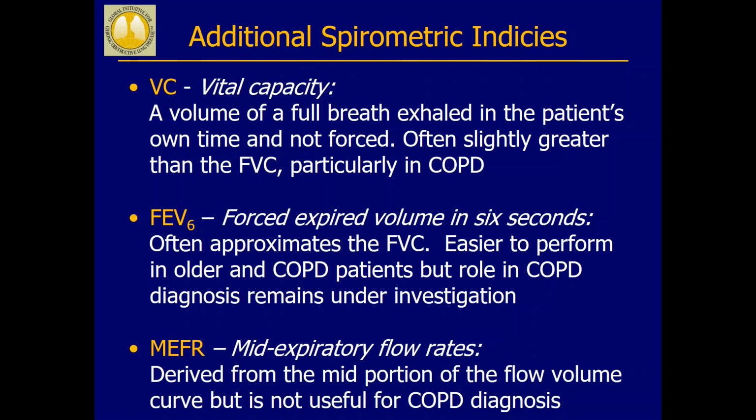FEV6 is the forced expired volume in 6 seconds, and it approximates the FVC. There's physiological reasons for that. Patients with COPD may exhale for more than 6 seconds, sometimes 10 seconds. There's one or two patients I have who take 15 seconds to fully exhale because of the lung disease. But current evidence doesn't clarify whether we should use that or not, so you still use FEV1 and FVC.